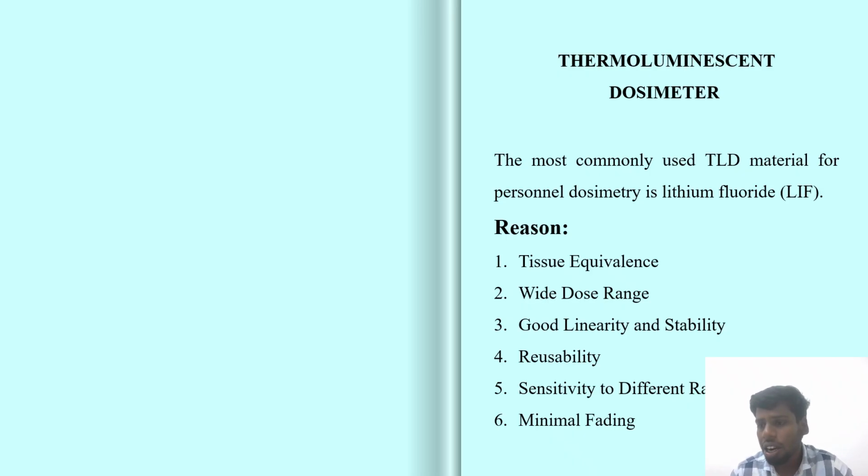The ionizing radiation will interact with the crystals and trap these electrons. After that we have to read out how much radiation has been exposed or absorbed. After the exposure time, usually 2 to 3 months, the badge is taken to a TLD reader.